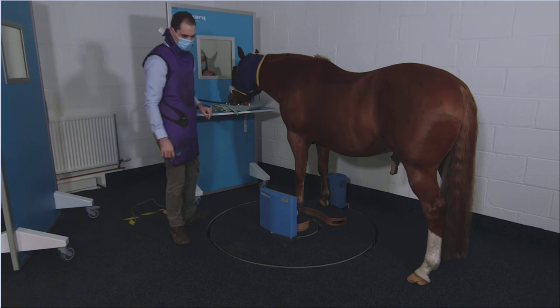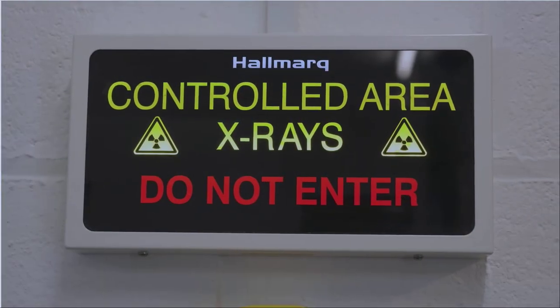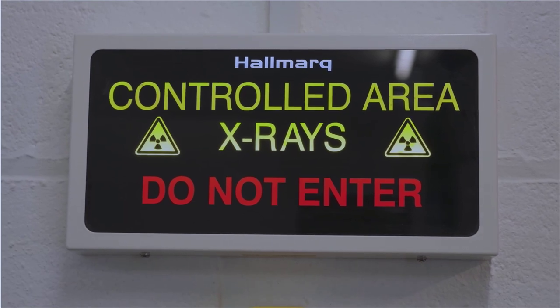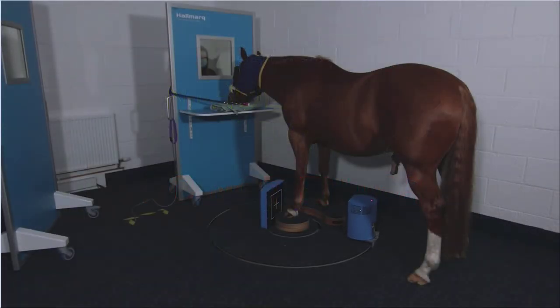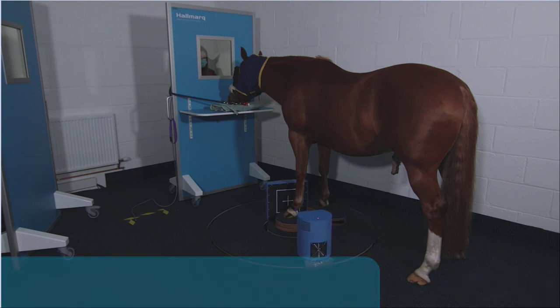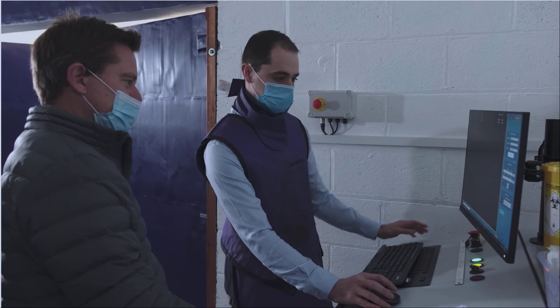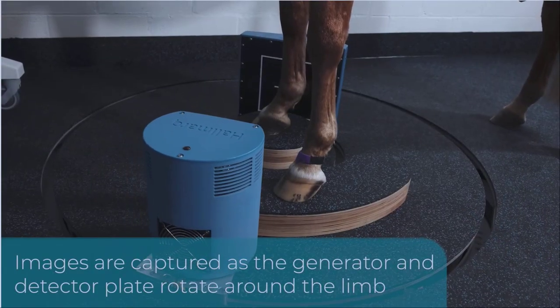The Velcro strap you see there, the purple Velcro strap, holds a little ball bearing, which is what we use for motion correction. It identifies the position and then the computer works out how it's moved and how to correct it. You can see this video was made just after COVID.